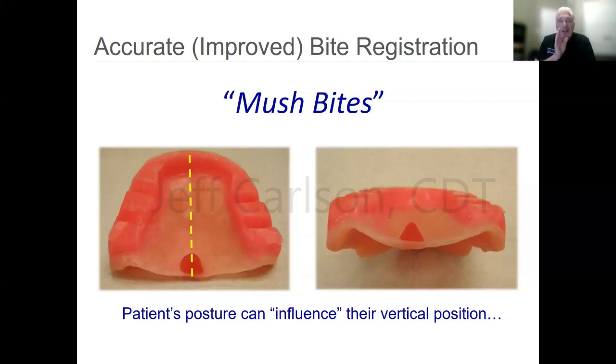It's almost physically impossible for you to move your mandible and the tongue not move, meaning that the patient keeps their tongue back on that wax. The tongue will act as a centering mechanism to help them go into more of a pure closing arc. So as you're watching, maybe you mark a dot on the nose, a dot on the chin, and you have a Boley gauge or something, and you're having them close down a little more, and stop. It really helped to eliminate stopping left or right, but it was more of a pure bite.